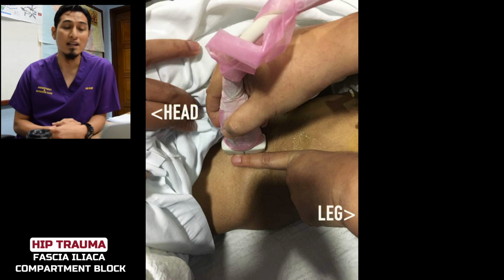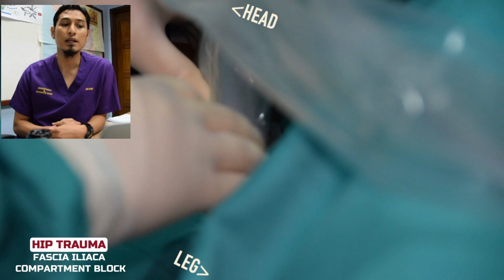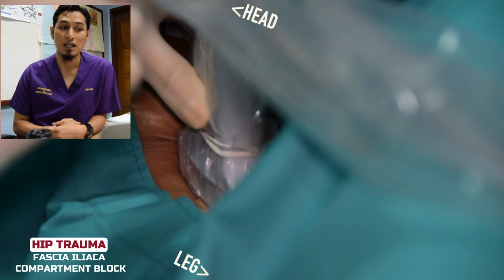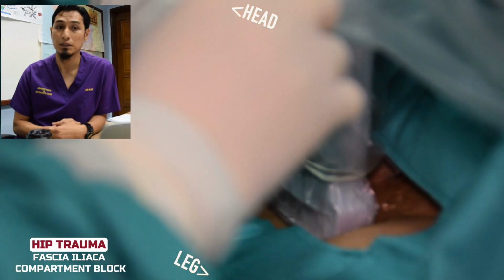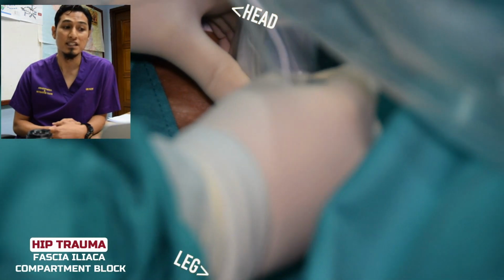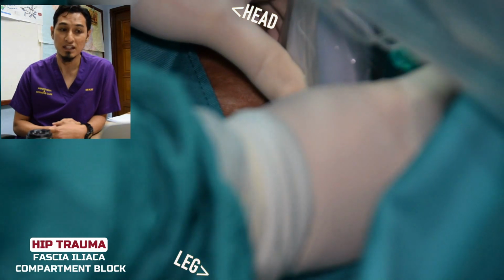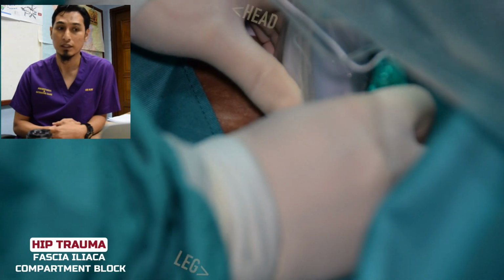Patient in supine position. First, we identify anterior superior iliac spine laterally. Place an index finger immediately medial to the spine. Align a high frequency linear transducer immediately next to this finger with the caudal end of transducer just above the inguinal ligament. Alignment of this transducer should be superior medial to inferior lateral, from cranial to caudal.